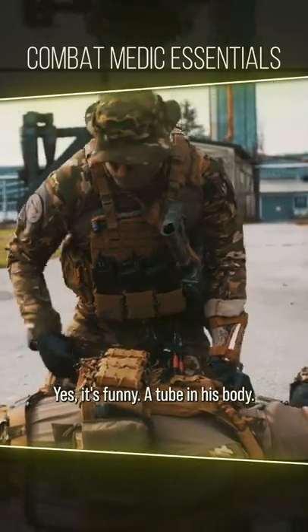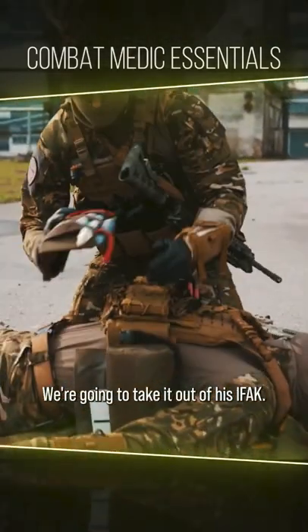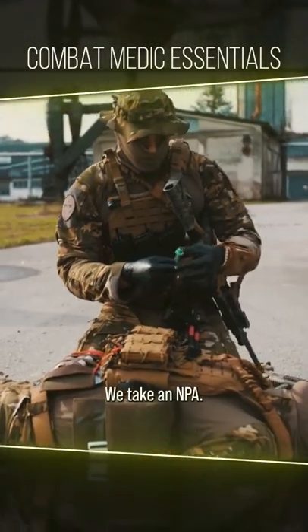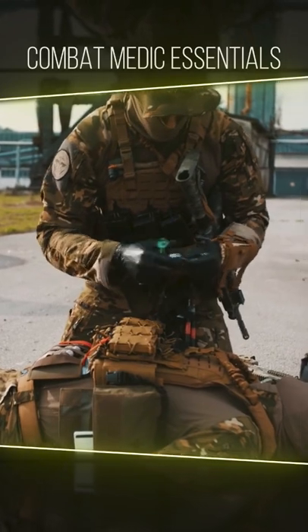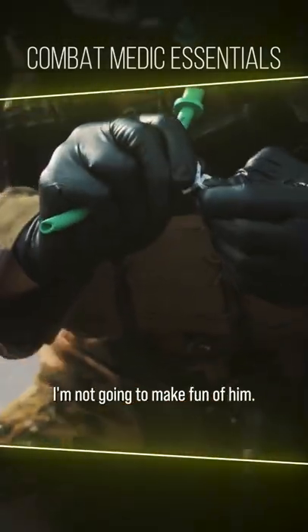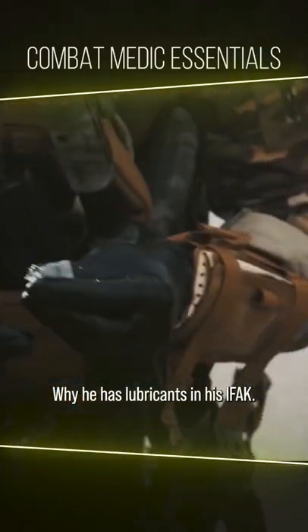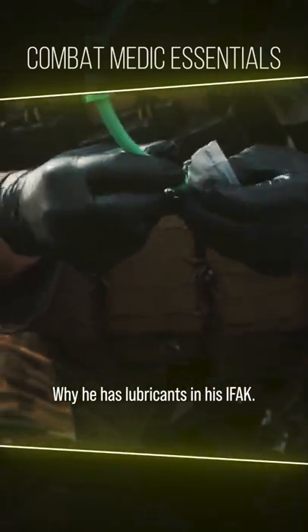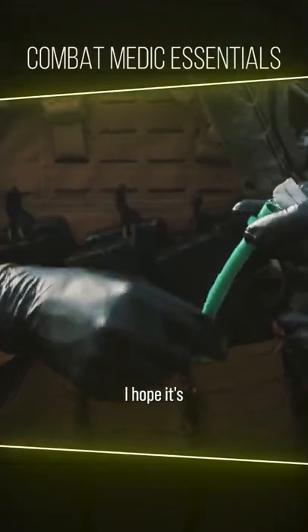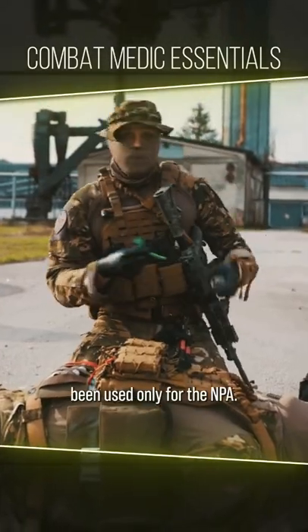Yes, it's funny — a tube in his nose. We're going to take it out of his IFAK. We take the NPA and our trusty lubricant. I'm not going to make fun of him for why he has lubricant in his IFAK — it can be used in many different ways. I hope it's being used only for the NPA.